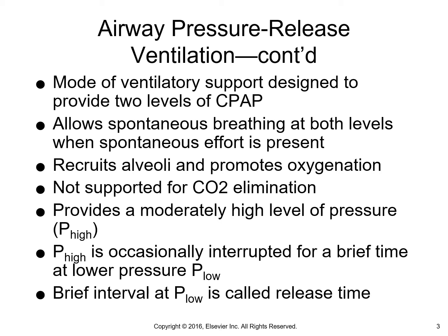Basically it has, like I said before, two levels of CPAP, allowing patients to breathe spontaneously at both levels. It provides a moderately high level of pressure, which they call P high, and then P high is occasionally interrupted for brief periods of time at a lower pressure called P low.